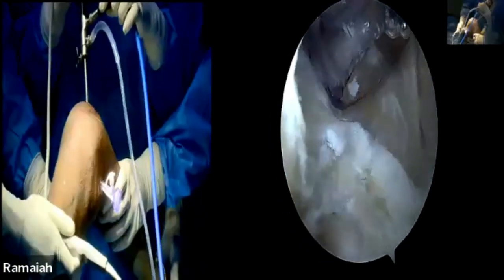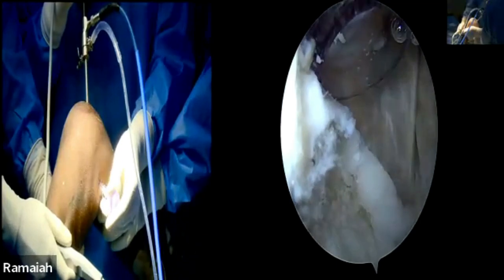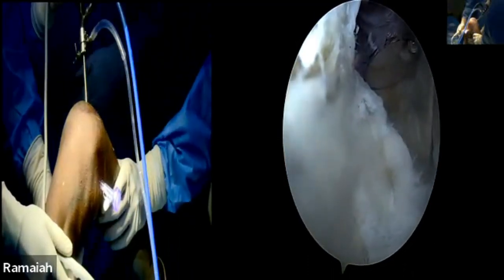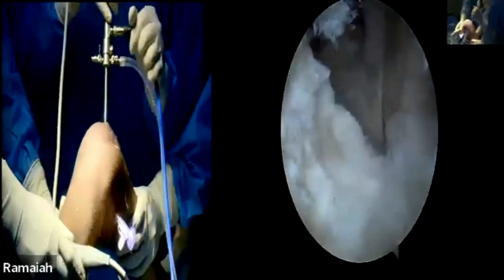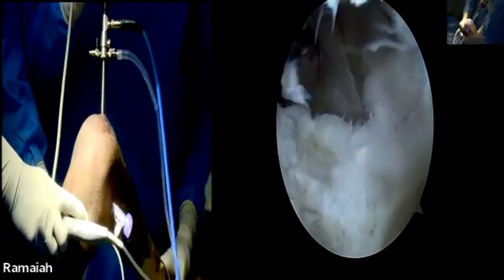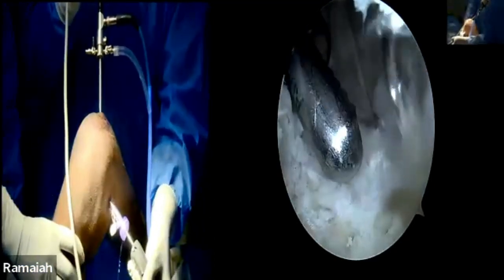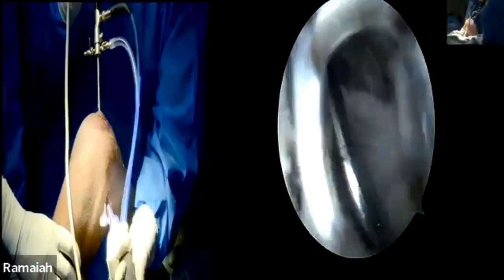If I rotate the light source you can appreciate the capsule where the cannula has come from. Madan was talking about two portals in the posteromedial — it's a good method because you can visualize in one portal what's happening at the proximal tibial posterior surface and use the other for suture management and clearing the footprint. I keep the shaver blade facing the tibia, not toward the capsule, because the vital structures are there.